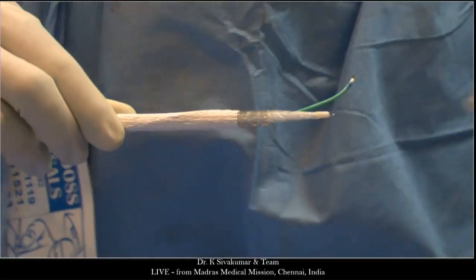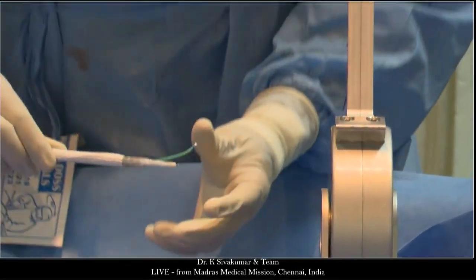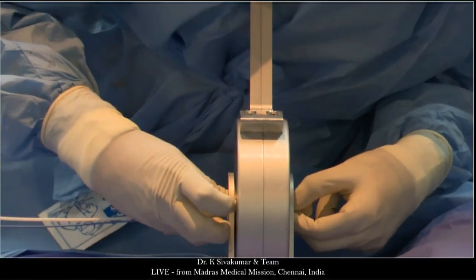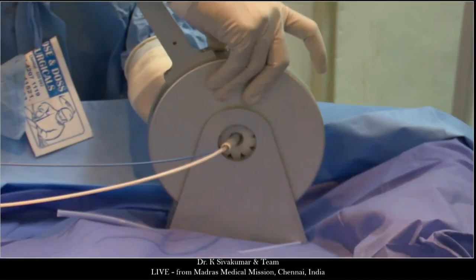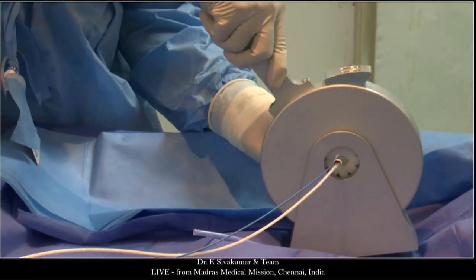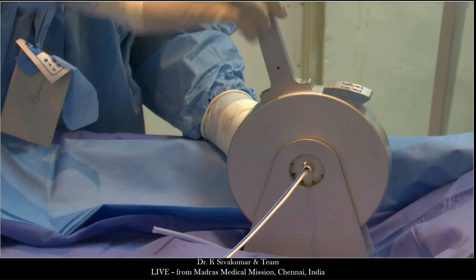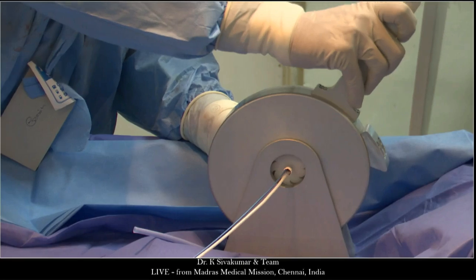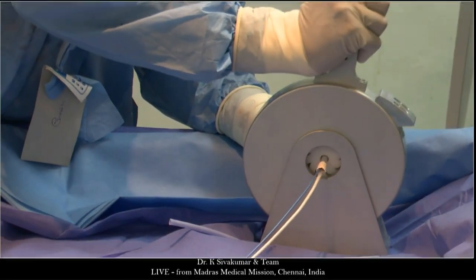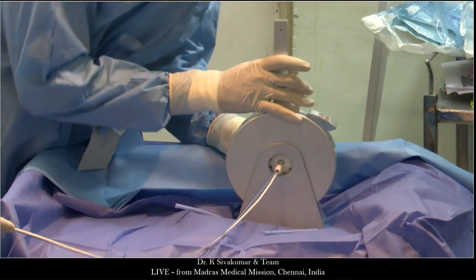So now I'm going to use a crimper. So this is the crimper. In this crimper, this is something similar to an Edwards crimper. So Sivakumar, you said the Z-Med diameter is 18? Z-Med diameter is 24. 24, but length is 8 centimeter. 8 centimeter, yeah. See, I'm using the crimper. This is a crimper made by Zephyr.